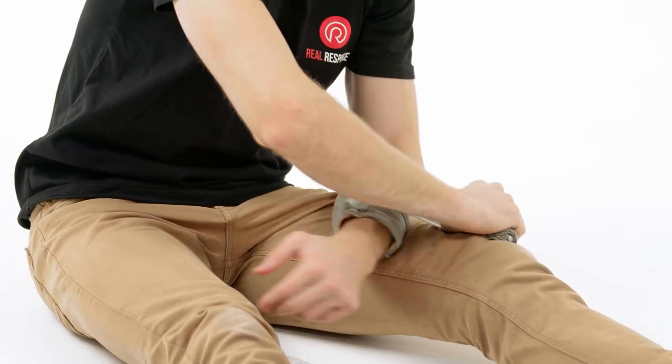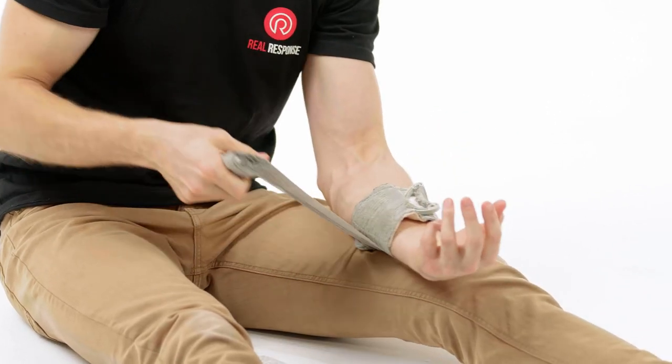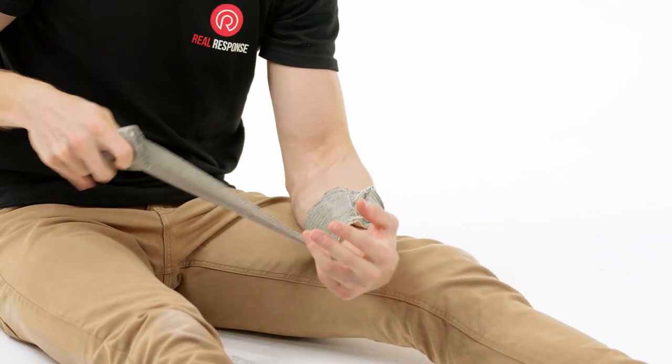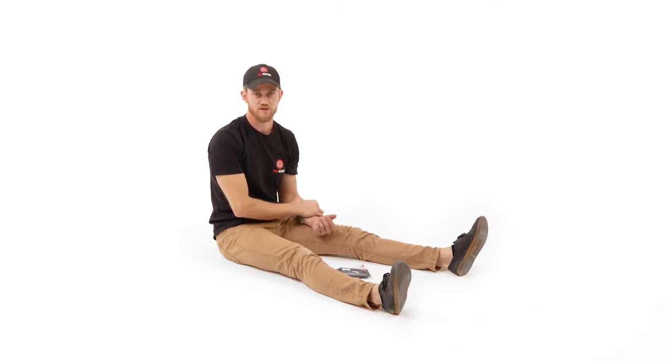Once you've done that, you then want to wrap the bandage around and feed it through the pressure applicator. Once you've done that, feed it back through and continue to apply pressure as you would with any other application — you can just put it by your side and apply more pressure with your own hand. From here, you then look around the rest of your body to see if there are any other hemorrhages you need to control.